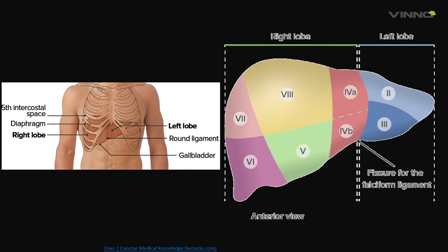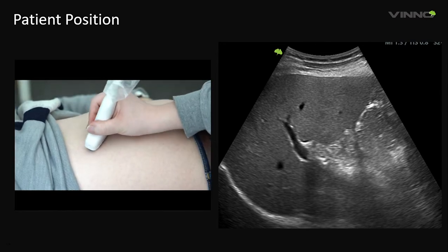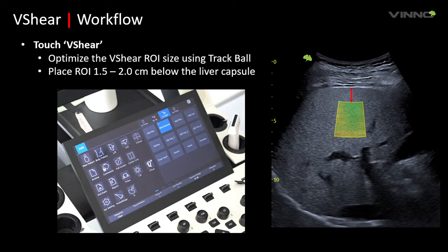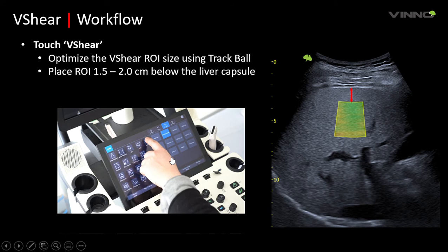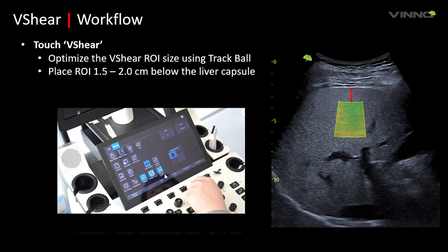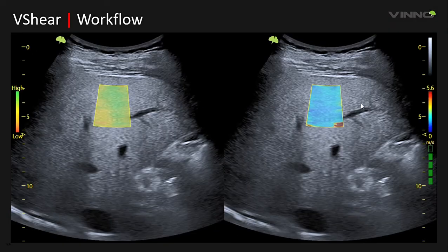On the left you can see the probe position for the intercostal scan, and on the right a 2D image of the intercostal scan plane showing the right lobe of the liver, segments 7 or 8. Once this image is acquired, on the touch screen touch VShear to enable the VShear ROI function. Position the ROI approximately 1.5 to 2 centimeters below the liver capsule, as shown with the red arrow. Enable the reliability map and motion stability index, ensure the ROI is perpendicular and then parallel to the liver capsule with the upper plane of the VShear ROI.